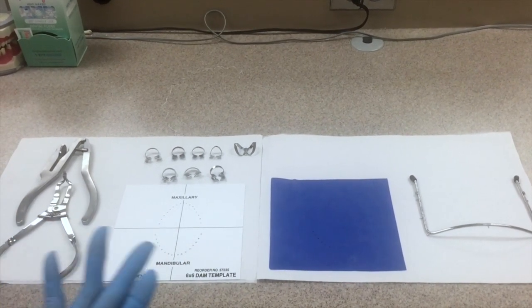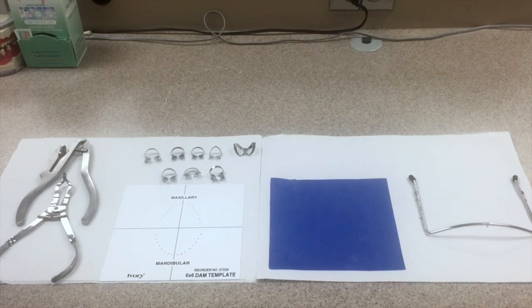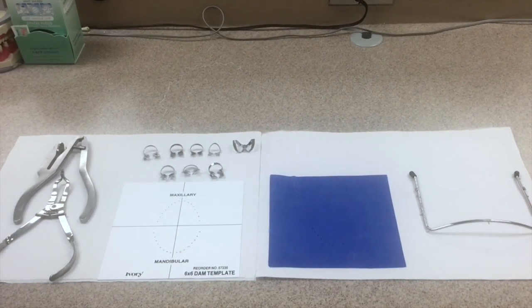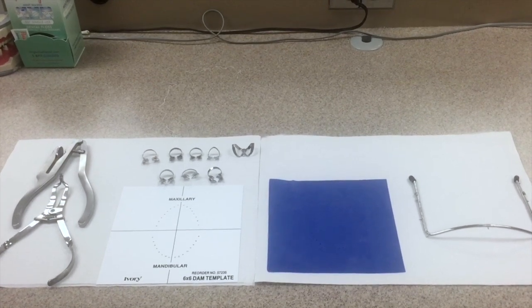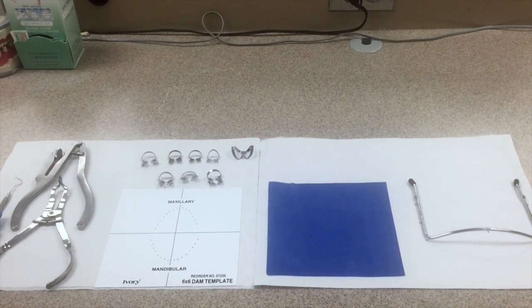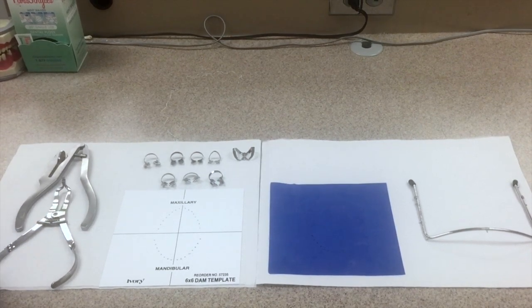This is required whether we are doing a composite restoration or an amalgam restoration. If you can't do it, you are going to fail the test, and we are thinking positively, no one is going to fail.